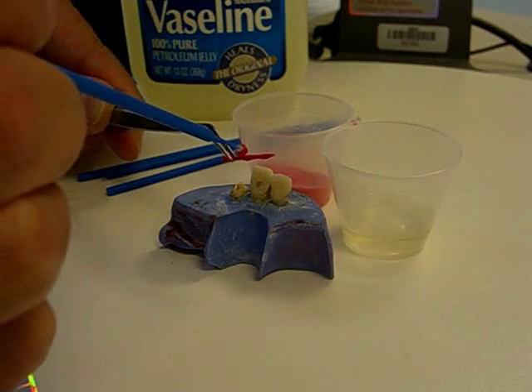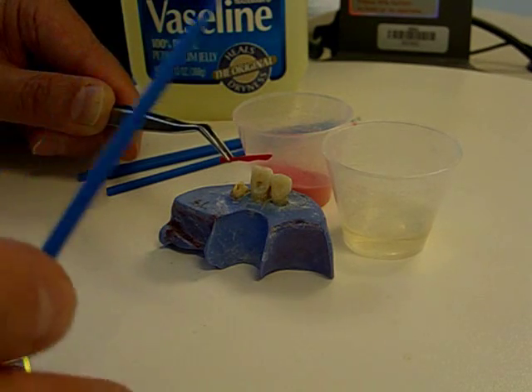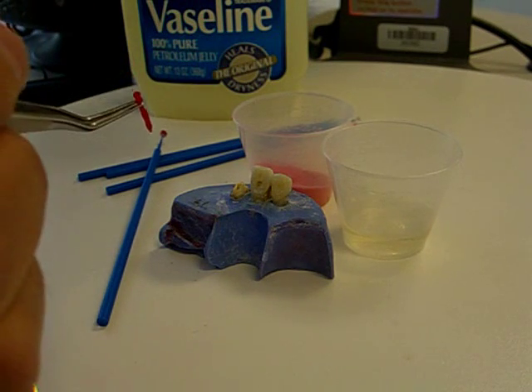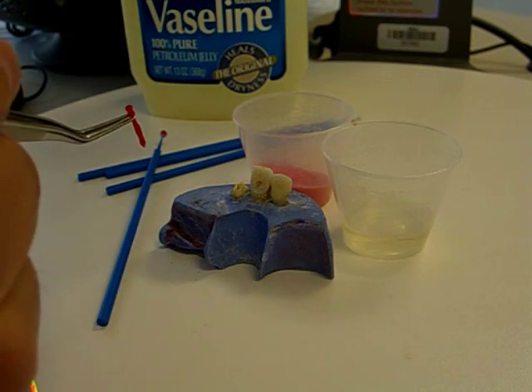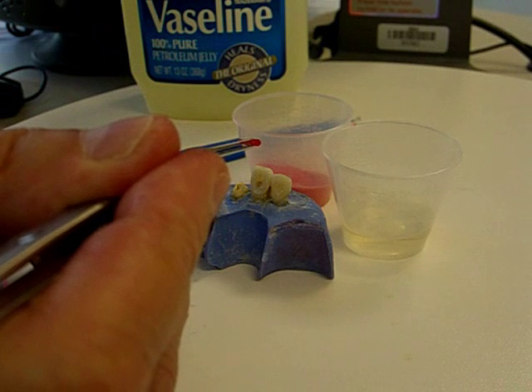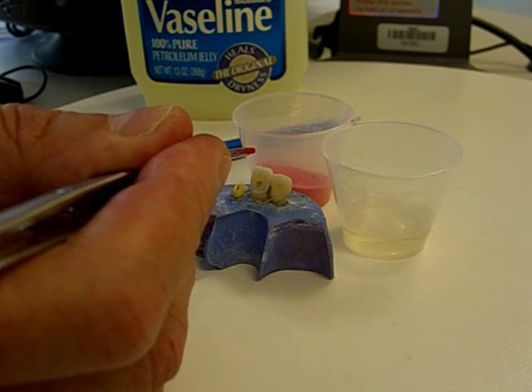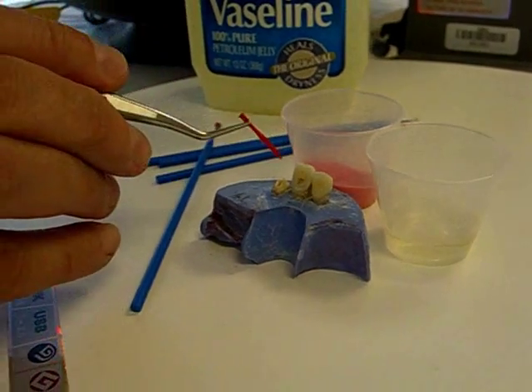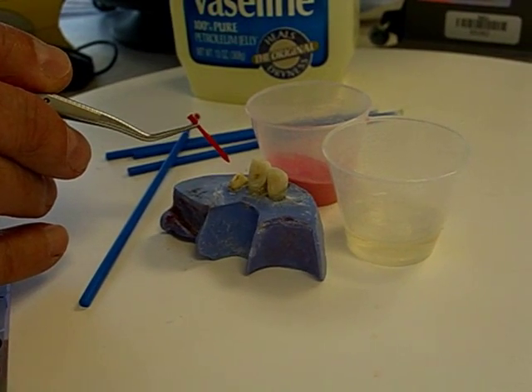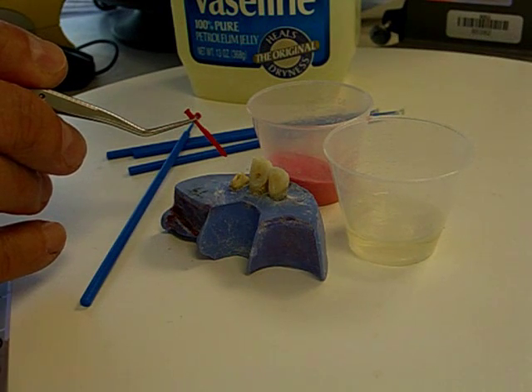Let's remind the students that at all times the plastic post should go all the way to the length of the post space. The plastic sprue has been lined with the GC monomer and polymer. I'm going to allow that to frost up just a little bit before placing it in the canal space, ensuring the sprue pattern extends all the way down to the apical five millimeters.